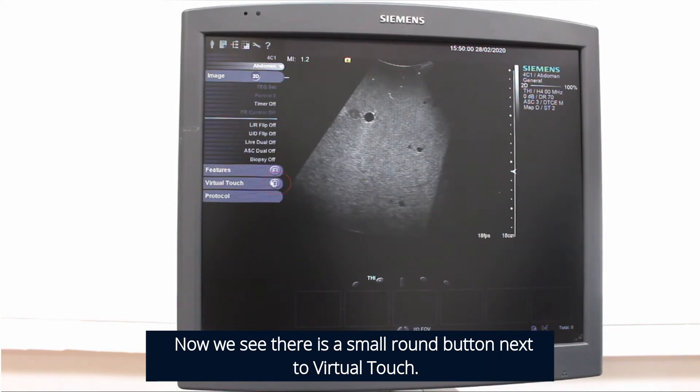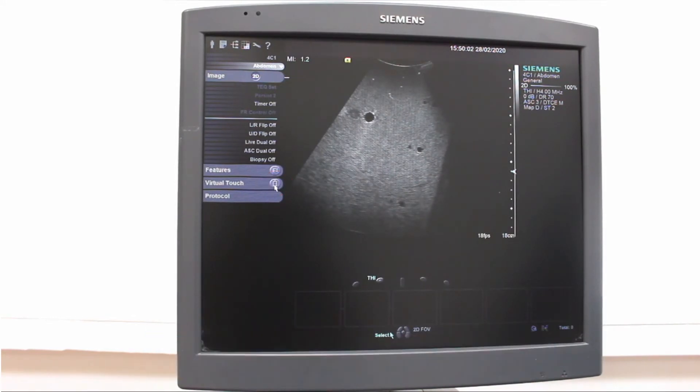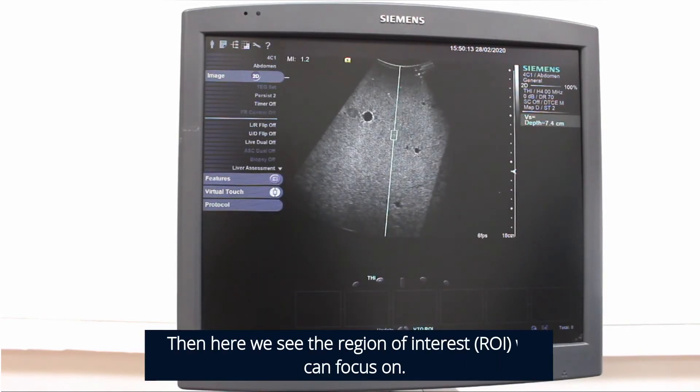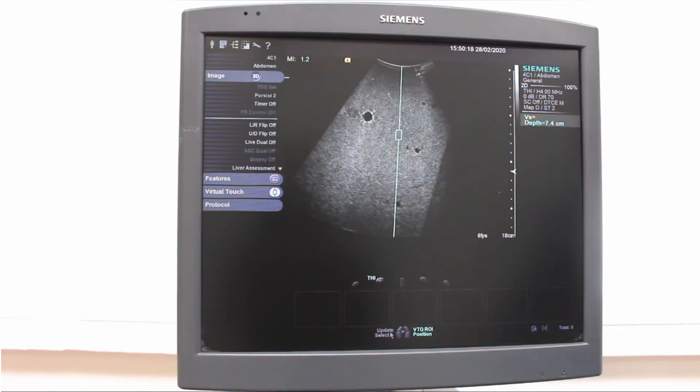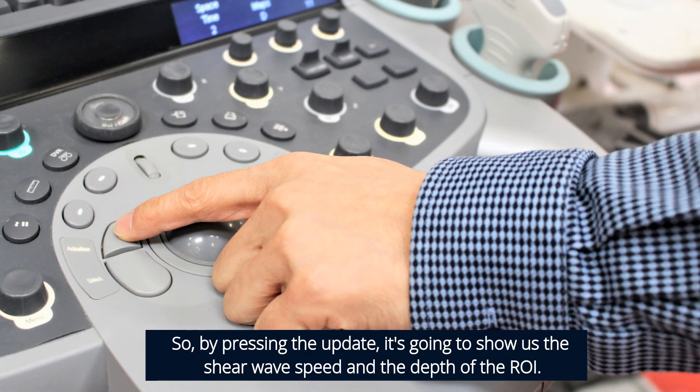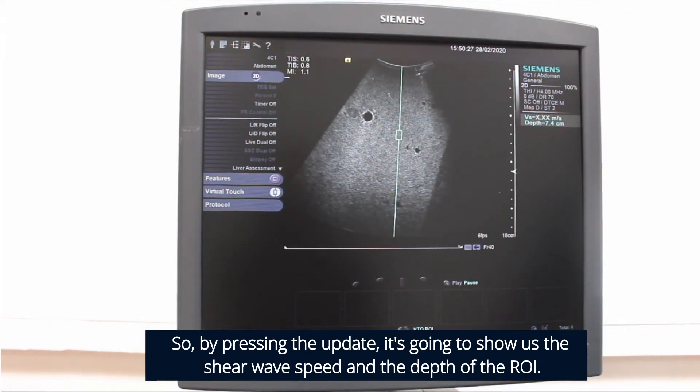Now we see there's a small round button next to Virtual Touch. We can apply the Virtual Touch Quantification technology by pressing this round button. Here we see the region of interest we can focus on. By pressing the update, it will show us the shear wave speed and the depth of the region of interest.